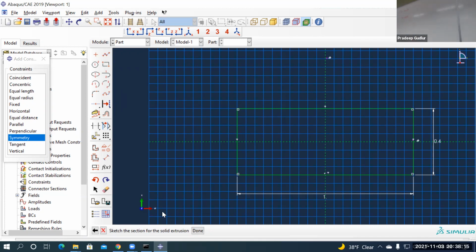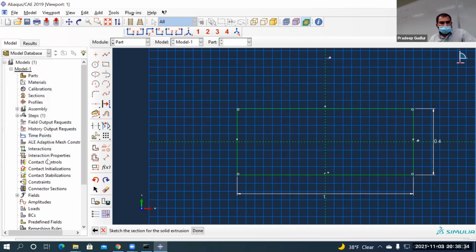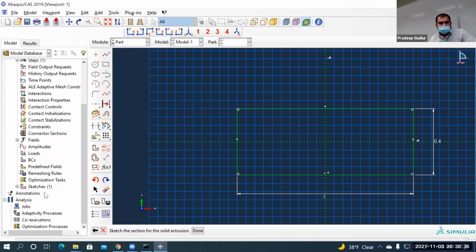All I did was construct a rectangle of some dimensions. Before I extrude it, I'm going to save the sketch. We brought in a sketch before, but we haven't saved a sketch. That's how you save the sketch. Save sketch as, I'll leave it as Sketch 1. And when I did that, you would see it went to the sketches option here. So that's the Sketch 1 I just saved.